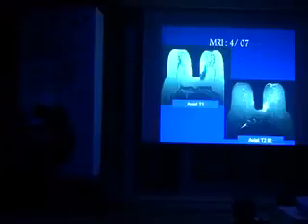And those are the pictures of the MRI, an axial T1 and an axial T2 inversion recovery. What do we see here? We see some abnormality at the site of the original tumor. One would say, okay, this is residual tumor. Others would say, no, this is a scar from the burned tumor. One would say, okay, come on, guys, let's inject contrast and see.